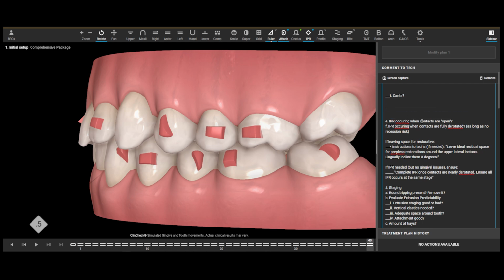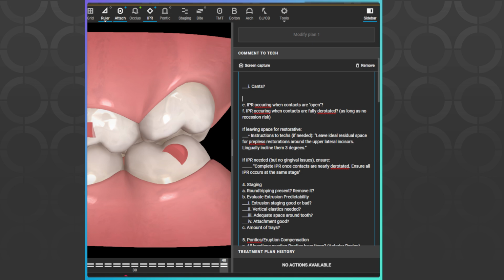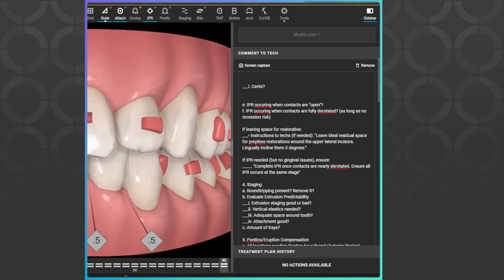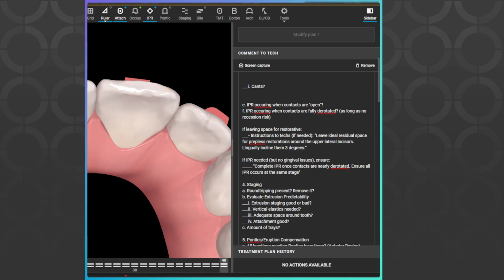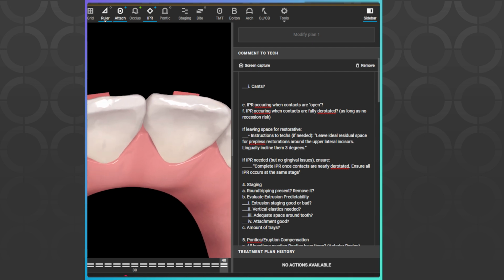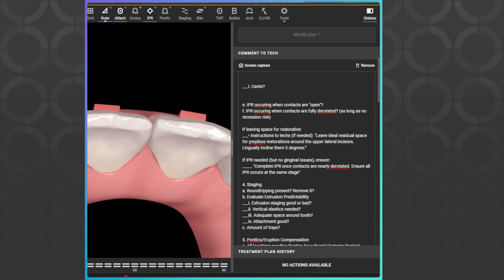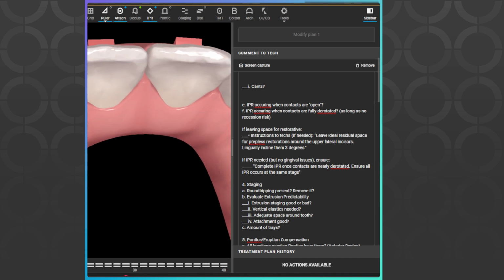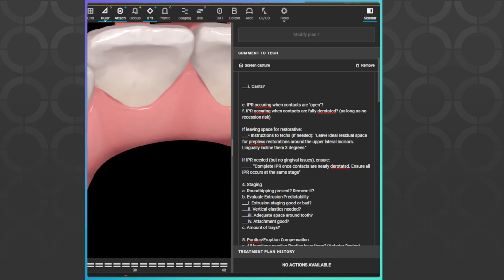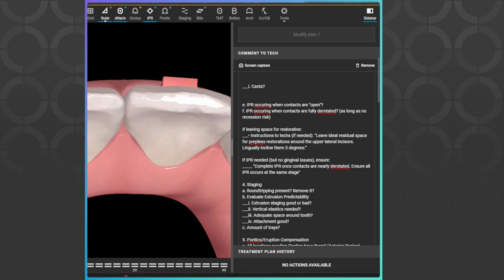Okay, next, IPR occurring when contacts are open. Okay, let's check it out. On our upper, I want to make sure that the teeth are derotated before IPR occurs. Because if we do IPR at aligner number 1 here, we're actually going to be doing more IPR off of the buccal of the tooth compared to the actual interproximal contact.